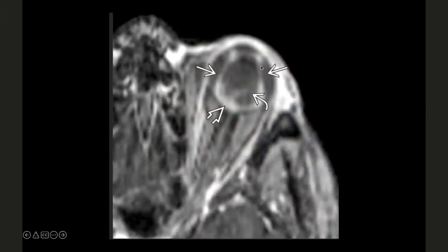But if I really want to decipher what's going on, I see this exudate and I'm thinking, is it choroidal or retinal detachment? But when I'm seeing that the thing is stuck here, it is not going to the apex, then what am I thinking? Based on what we read, what kind of detachment is this? Choroidal. Look at you. You guys already are like neuroradiologists. So there is an exudate. So definitely I'm going to put it in the space after the choroid, right? So this would be the suprachoroidal space or the subchoroidal exudate.